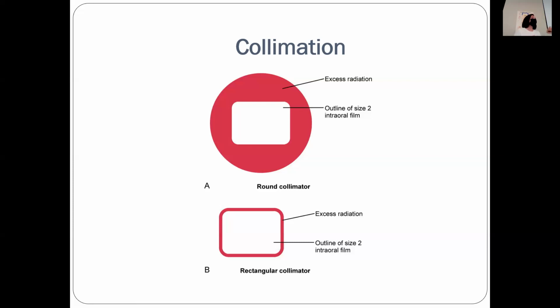A couple of reasons why we use it: if we teach you the hardest way first, you'll probably kill it in real life. And also, with your patients, you're inevitably going to take retakes, and you'll take more retakes now than you will later. If we take 9 retakes on a patient with our rectangular BID, they're still probably getting less radiation than normal dosing out in the world.